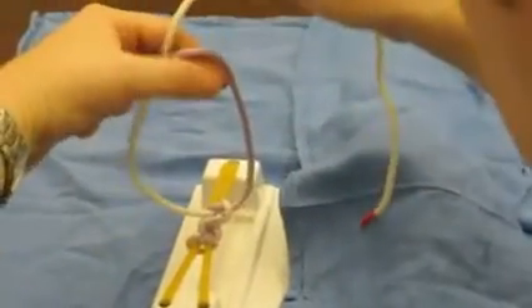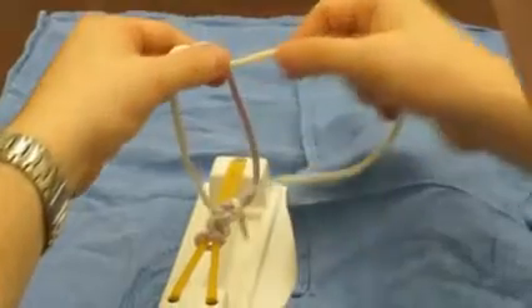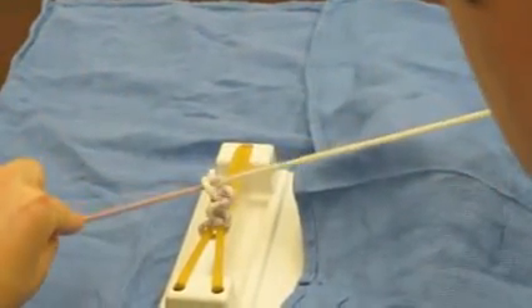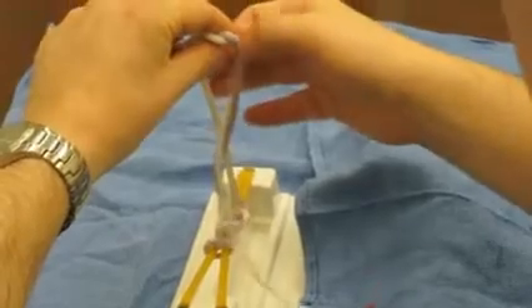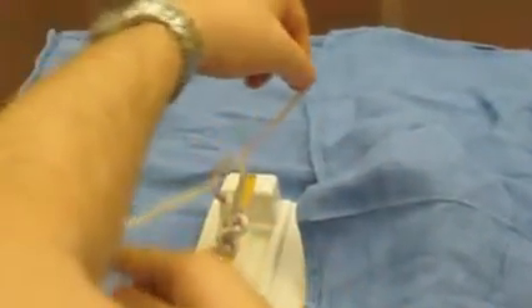Here it is in slow motion again. The loop is on the finger. The thumb goes towards the back, brings the tail forward, and the tail gets pulled down. On the second throw, the loop is made with the thumb. The finger comes forward to grab the tail. The tail gets pushed towards the back, then grabbed and pulled down to the opposite side.